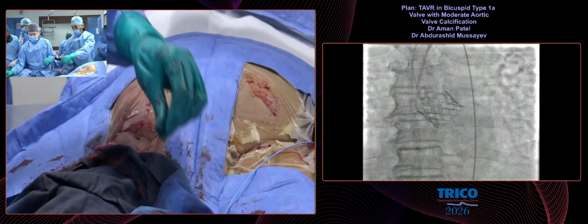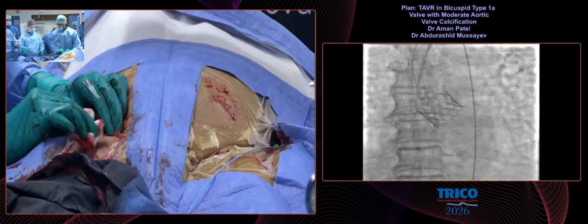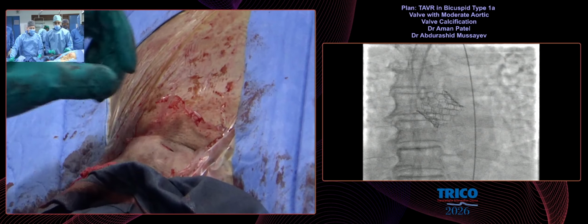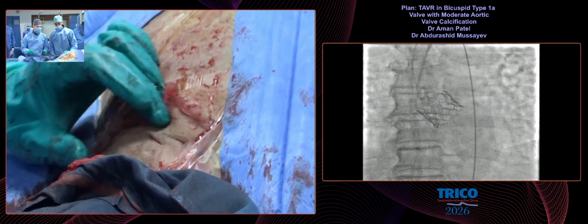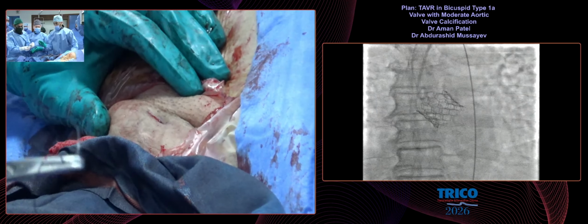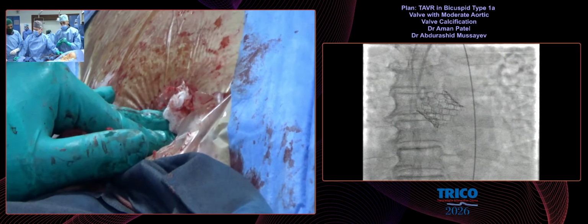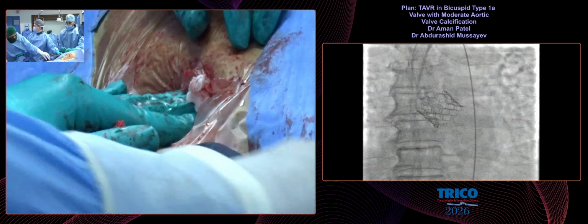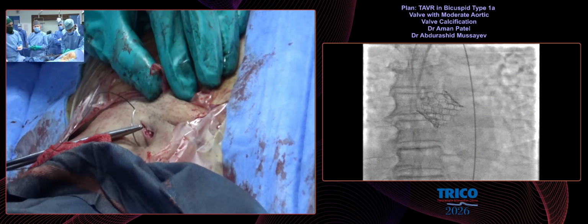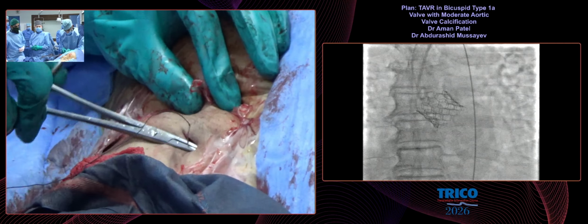Sorry, since you had a contralateral access, is it a safe practice to just take a DSA and come back to know whether there is any cinching? This is left radial access. Yeah, the contralateral access is in the left radial. Okay, that's wonderful. There was a very good paper from Italy. The second access does add significant complication from the femoral access. And this being Apex Heart Institution, every time they enter through radial, unless ruled otherwise.